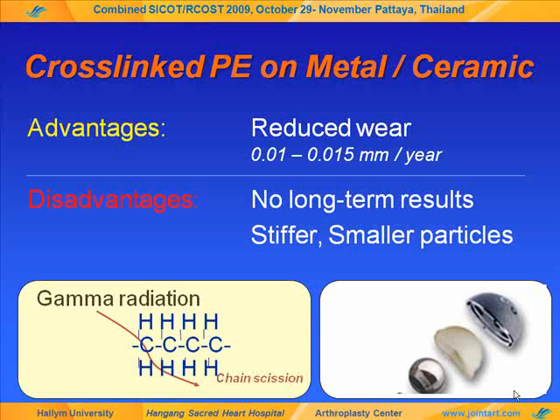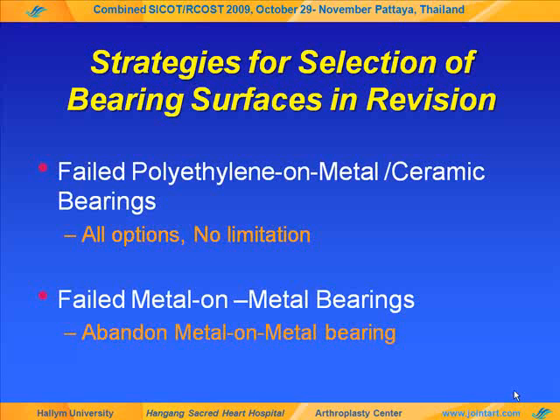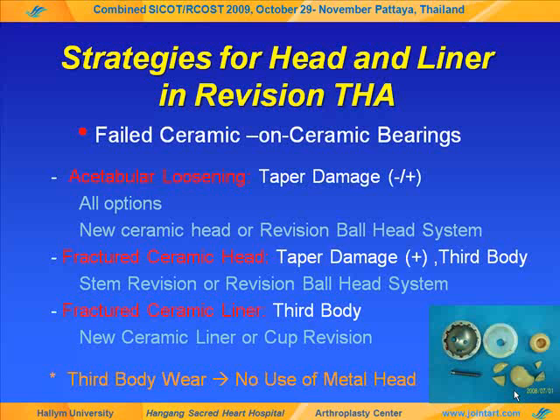However, each alternative bearing couple has advantages and disadvantages. Cross-linked polyethylene does not have long-term results, produces smaller particles and is stiffer, and metal-on-metal may have risk of elevated serum ion level, hypersensitivity, pseudotumor, and possibly long-term toxicity. And fragility and squeaking are the concerns of ceramic on ceramic bearing. During revision total arthroplasty, the strategy for selection of bearing couple is required according to the previous articulation. After ceramic on ceramic bearing, in a case which has third body, we should not use a metal head.